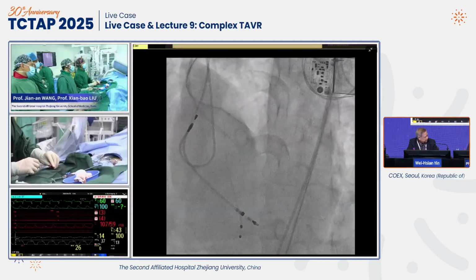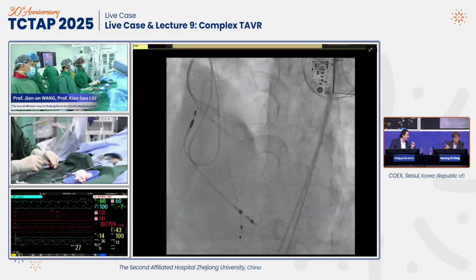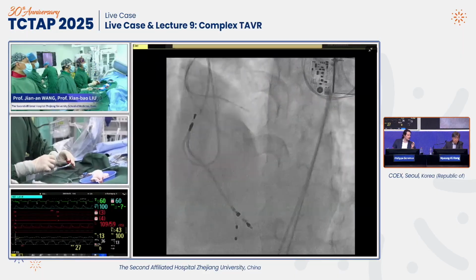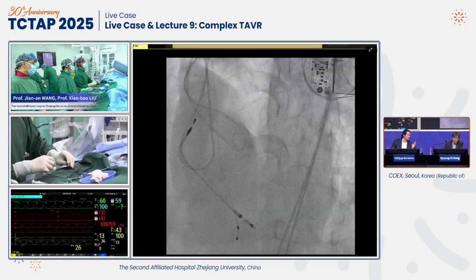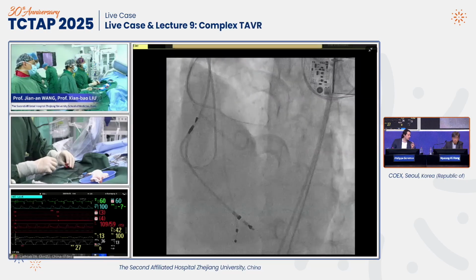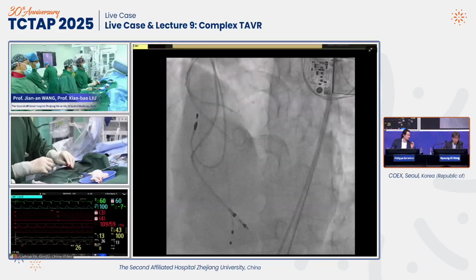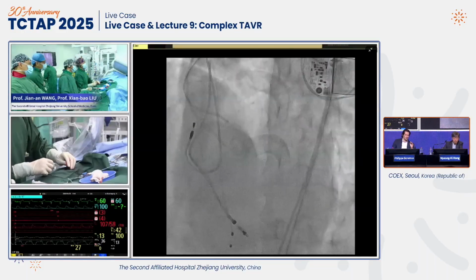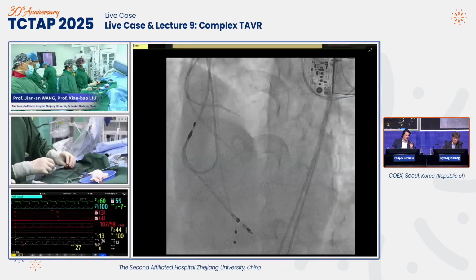That's my opinion. And I will say that this patient, you already start to pre-dilate, you're most likely going to have to post-dilate. So I think when there's multiple manipulation of the valve, especially highly calcified, you may have an argument. There's some sub-analysis that show that potentially prior stroke and also pre and post-dilation and self-expandable valve are associated with more benefit of neuroprotection. So we may have a rationale to use neuroembolic protection in spite of all the negative data.